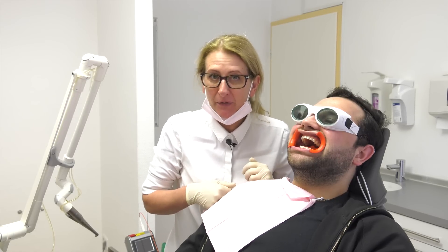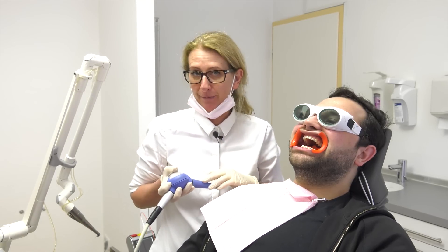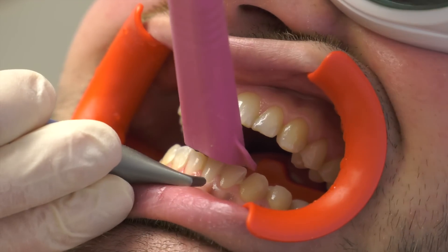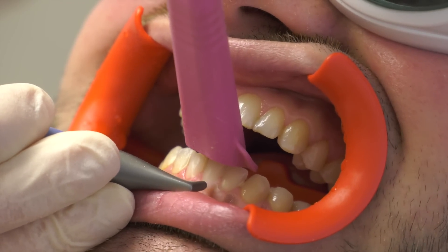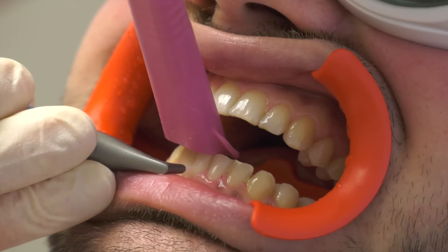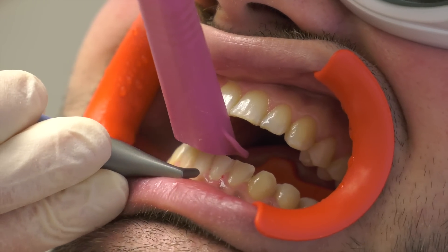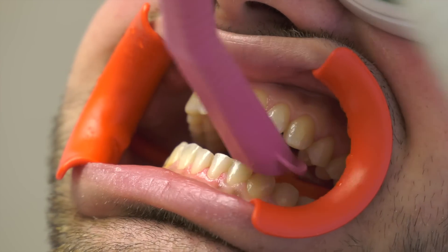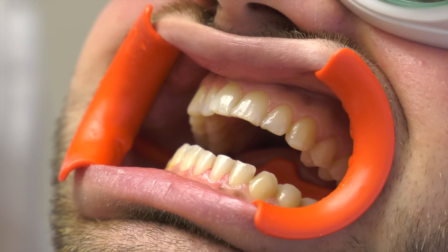Now let us go over to step number two: the polishing. You already know that we cannot polish with the laser, so we take the air flow. Now we do the polishing of the tooth surface by using the air flow with our granular nano beam, and it is an additive to get a very nice shiny surface.